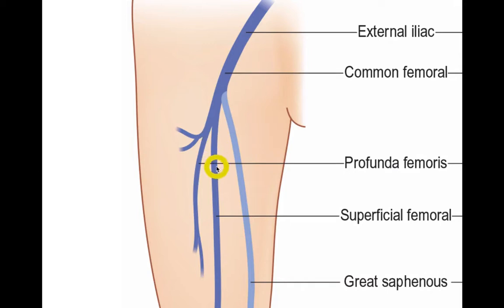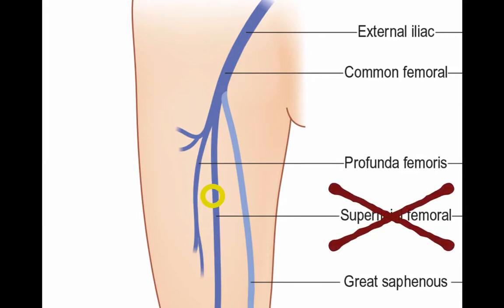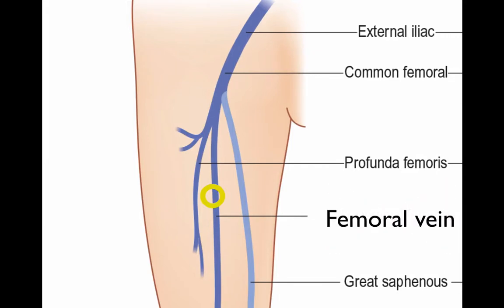You want to keep following that down, get the deep femoral vein as much as you can, but it gets kind of difficult to see as it moves down into the leg. Let's not call it the superficial femoral vein — let's call it the femoral vein, because that's actually what we call it now. Keep going down and follow the femoral vein a few inches down until at least the mid thigh. I'll often follow the femoral vein all the way down until it gets into the adductor canal, which is down almost by the knee.